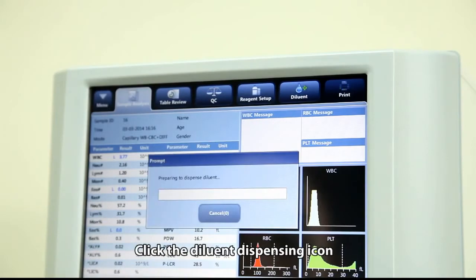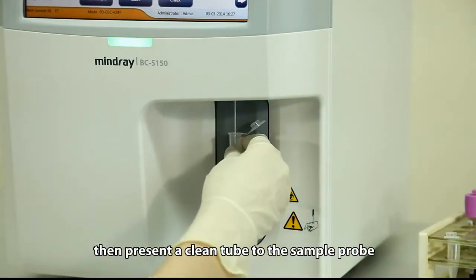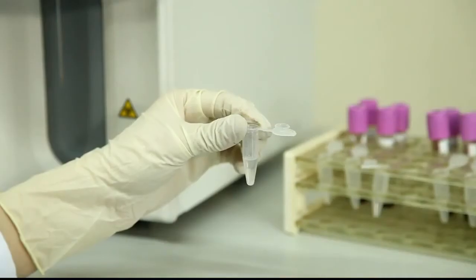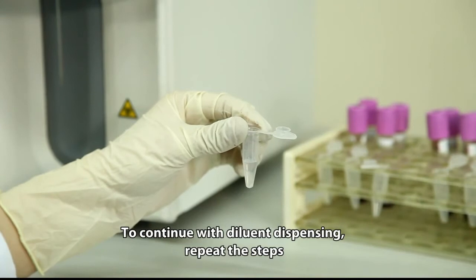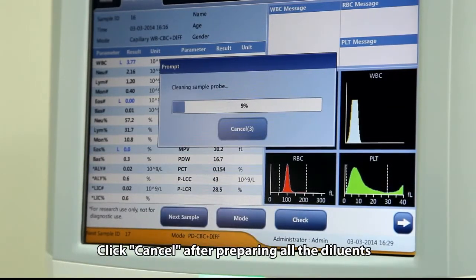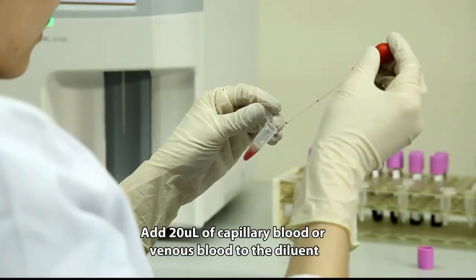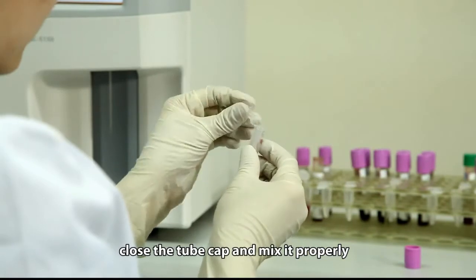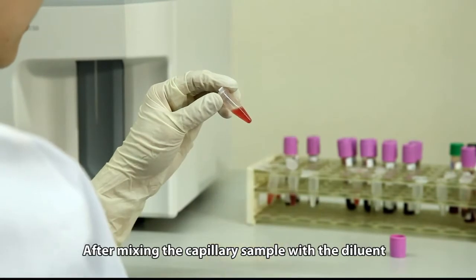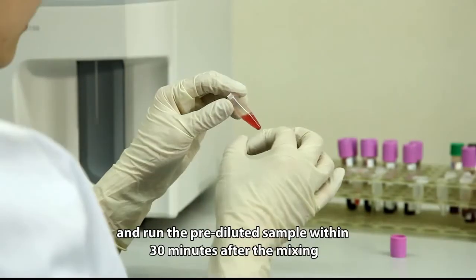Click the diluent dispensing icon, then present a clean tube to the sample probe and press the aspirate key to dispense 480 microliters of diluent. To continue with diluent dispensing, repeat the steps and click cancel after preparing all diluents. Add 20 microliters of capillary blood or venous blood to the diluent, close the tube cap, and mix it properly.